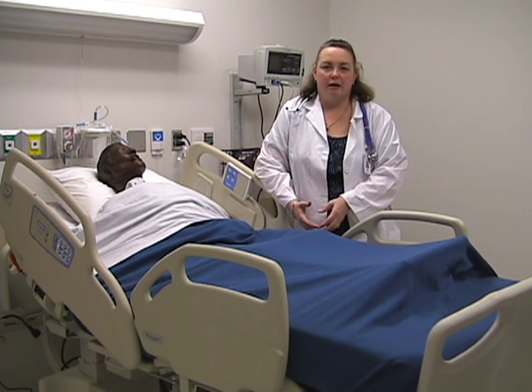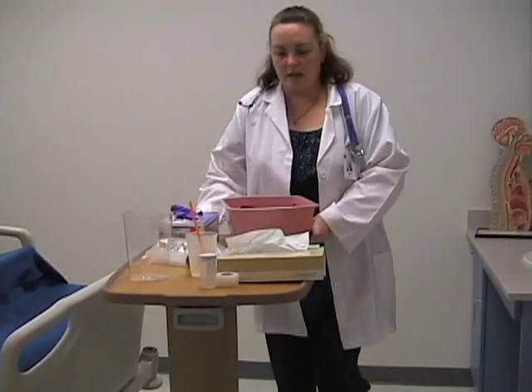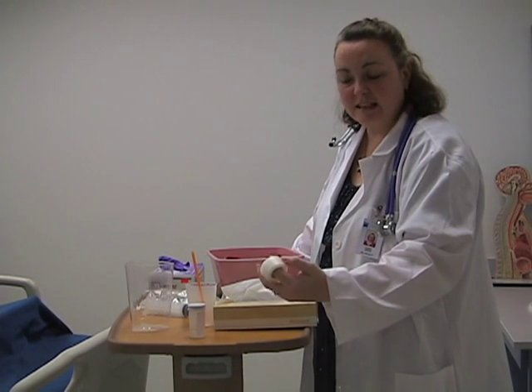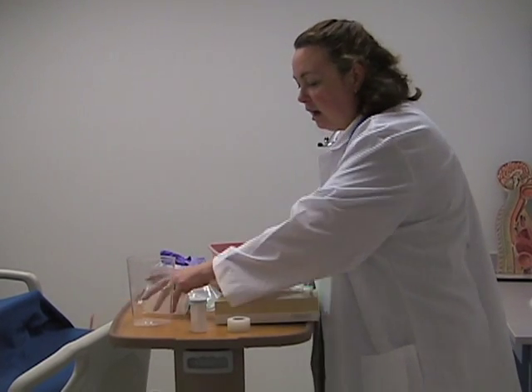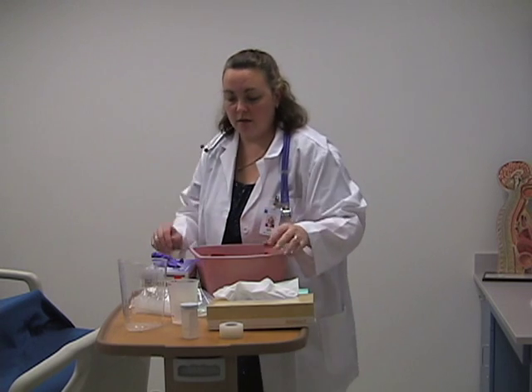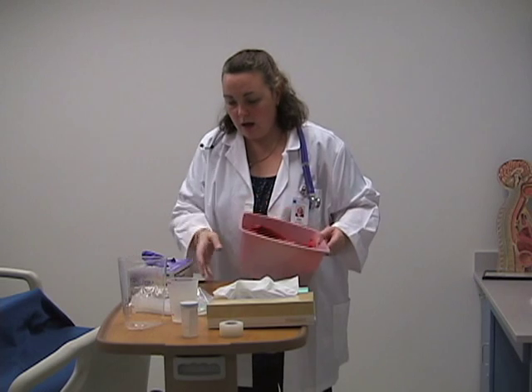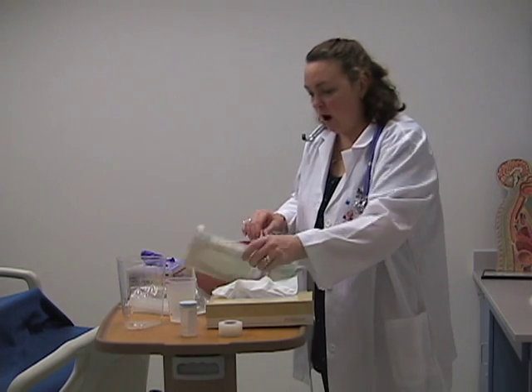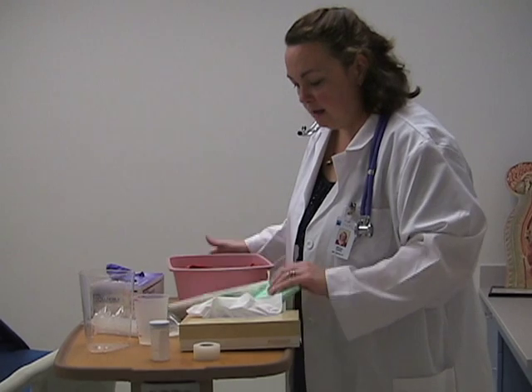With the supplies that you will gather, we need lubricant and tape. Be careful with the tape that you get — some patients do have allergies to plastic tape; paper tape or silk tape are available. We need a cup with a straw, sometimes a basin, a piston syringe, gloves, and an NG tube. For an adult, it's usually anywhere from 12 to 14 French, which is the average size. Always note on your documentation the size of the NG tube that you insert. We also need a basin and a waste receptacle for any emesis, and a disposable chuck to prevent spillage onto the gown or patient.